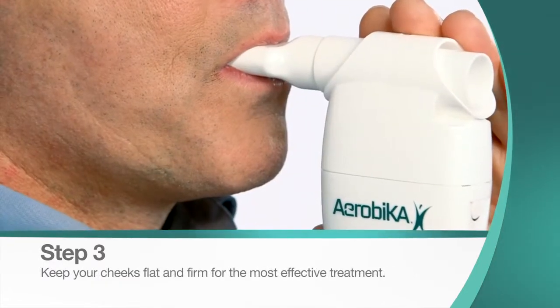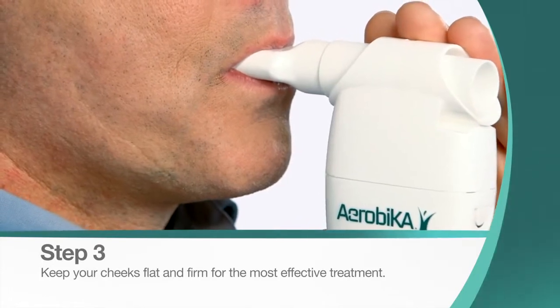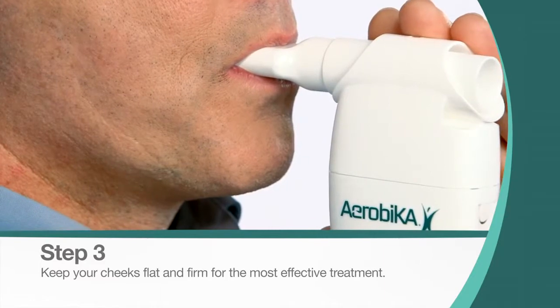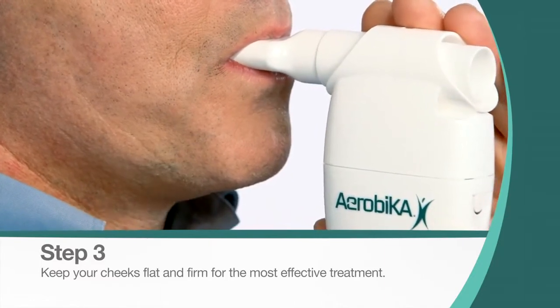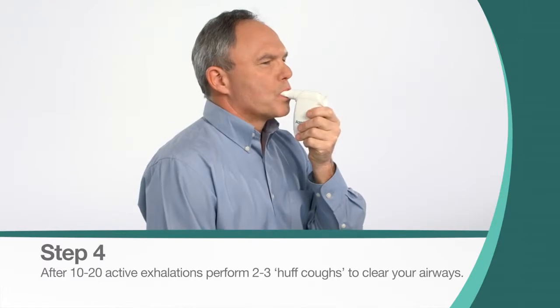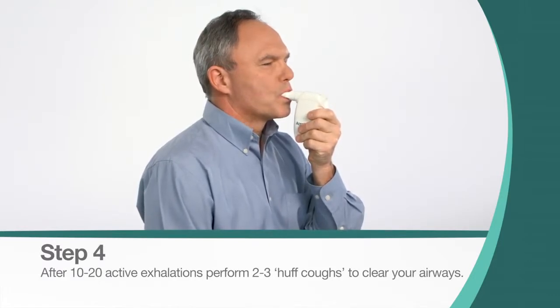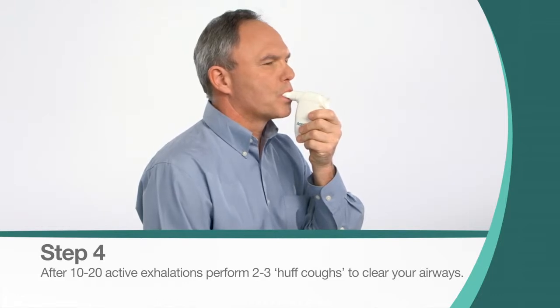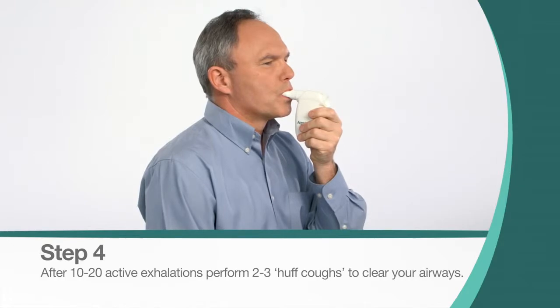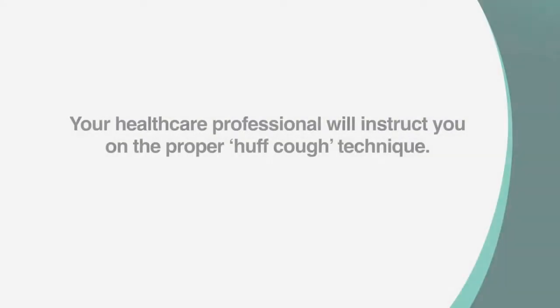Active exhalation should last 3 to 4 times longer than inhalation. Keep your cheeks flat and firm for the most effective treatment. Continue taking deep breaths and long exhalations for 10 to 20 breaths, or as instructed by your health care professional, after which you will perform 2 to 3 huff coughs to clear your airways. Your health care professional will instruct you on the proper huff cough technique.